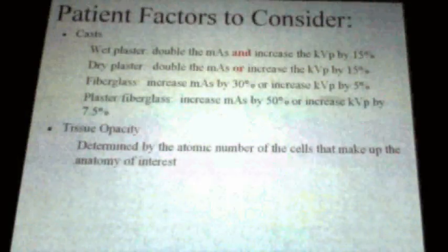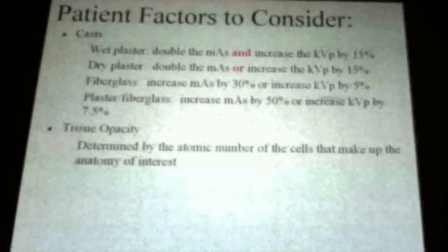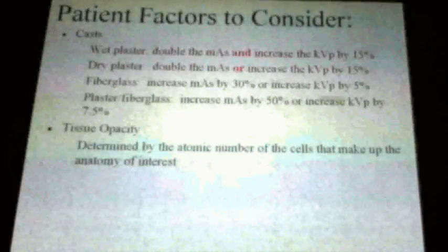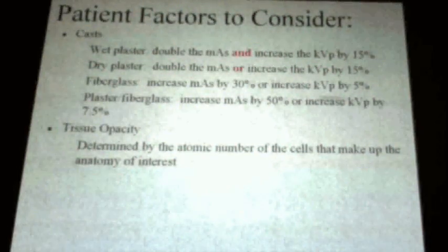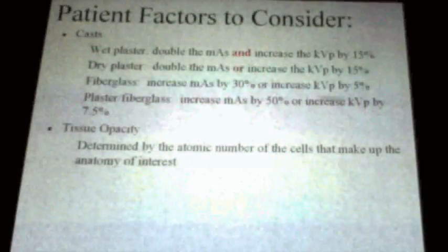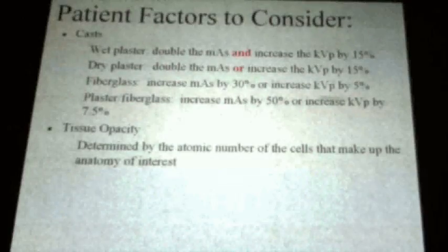Now think about our bodies. Our bodies have contrast, don't they? Because our body is made up of all different kinds of atomic numbers, and the primary beam is going to be attenuated differently as it goes through our bodies. That's why we have that show up on our image. But the table is the same thickness throughout the whole table. It's made out of the same element.